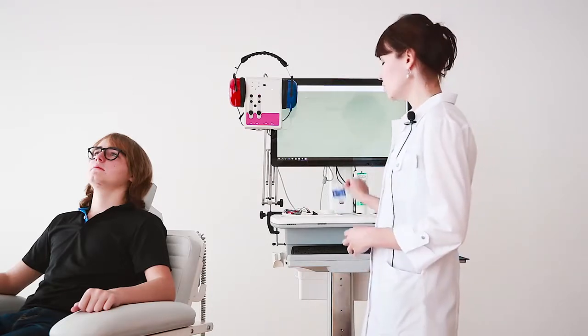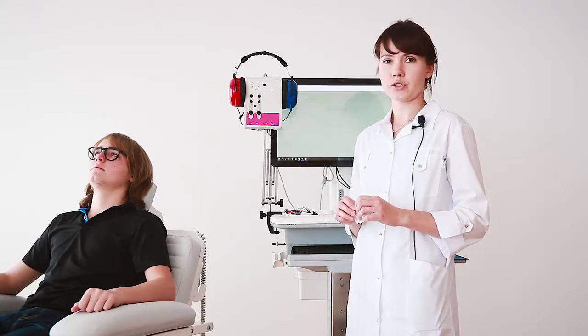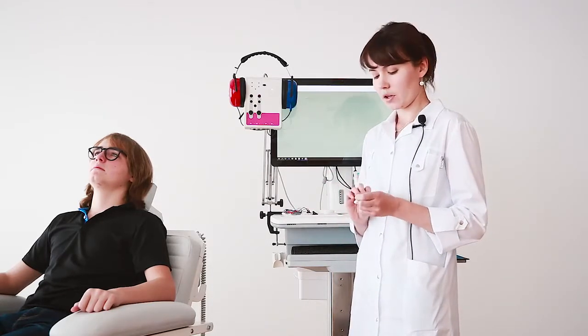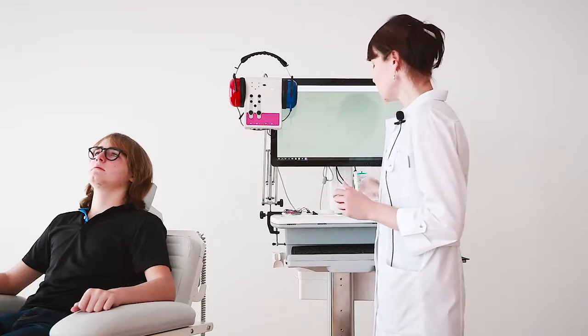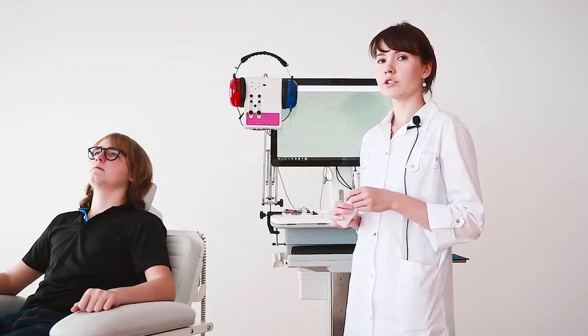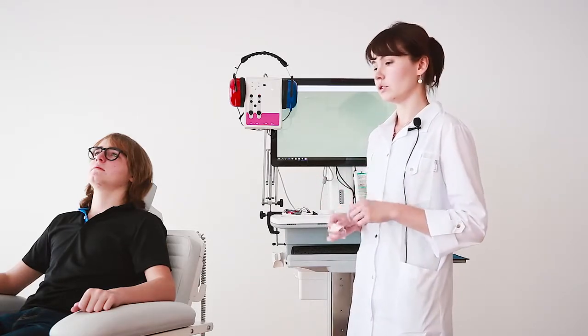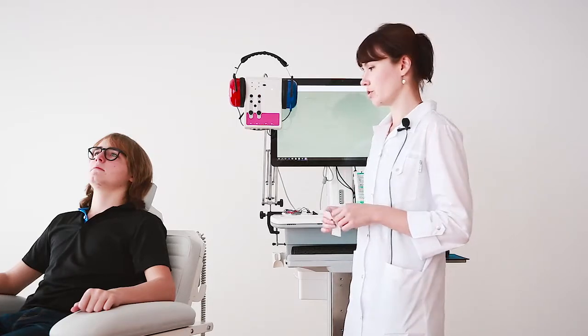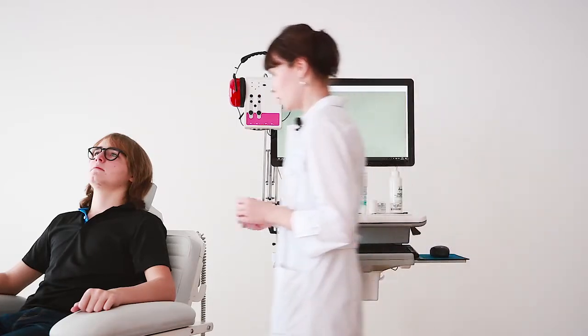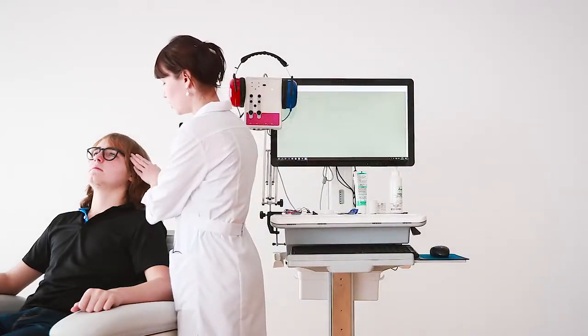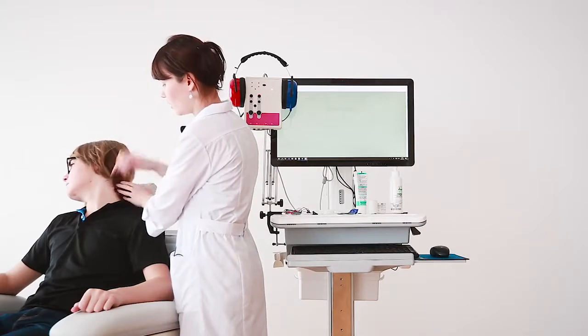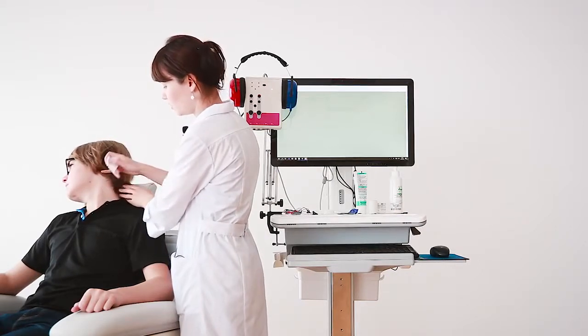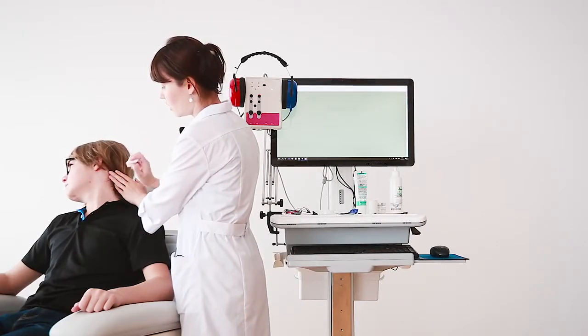To perform this kind of test we need to prepare the skin of our patient. We need to use a spirit napkin to decrease the impedance at our electrode positions.